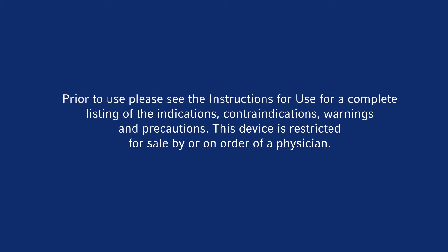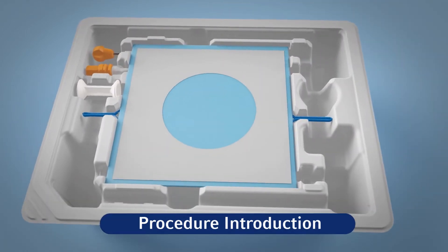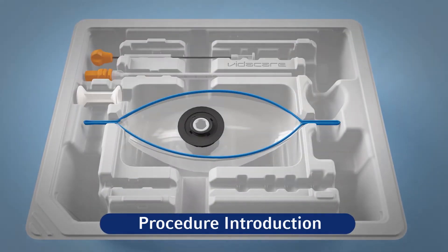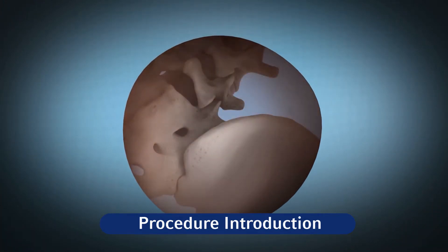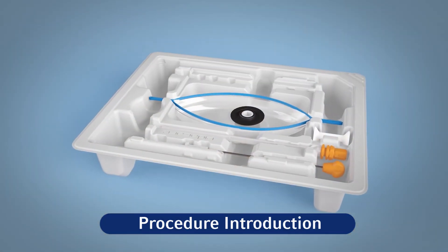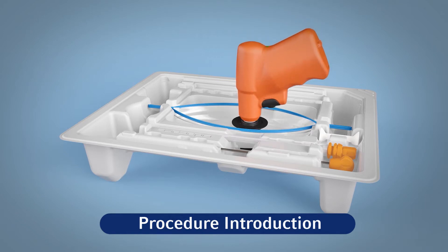After opening the product tray, place the non-sterile driver into the black connector in the sterile tray, with the driver handle towards the same end of the tray as the orange needle hubs.